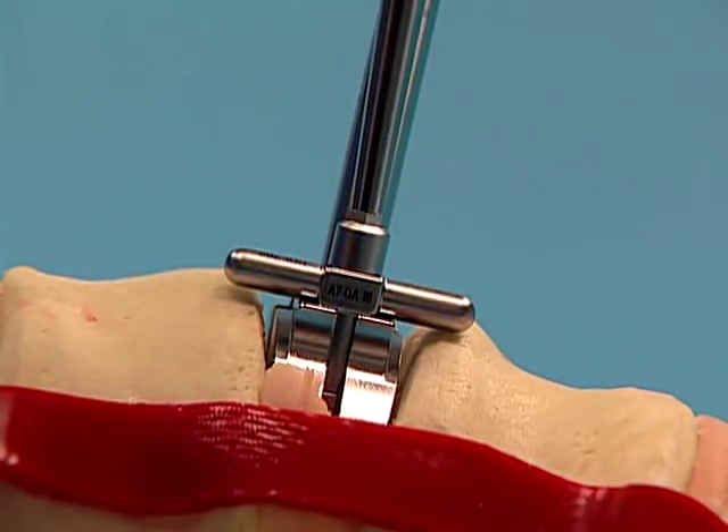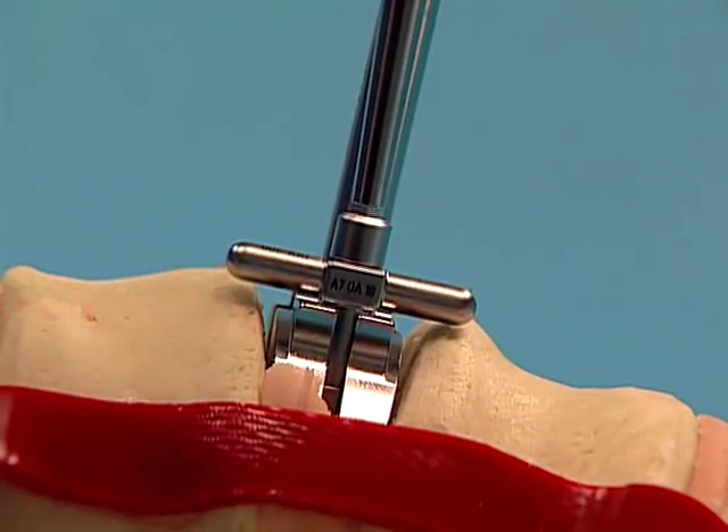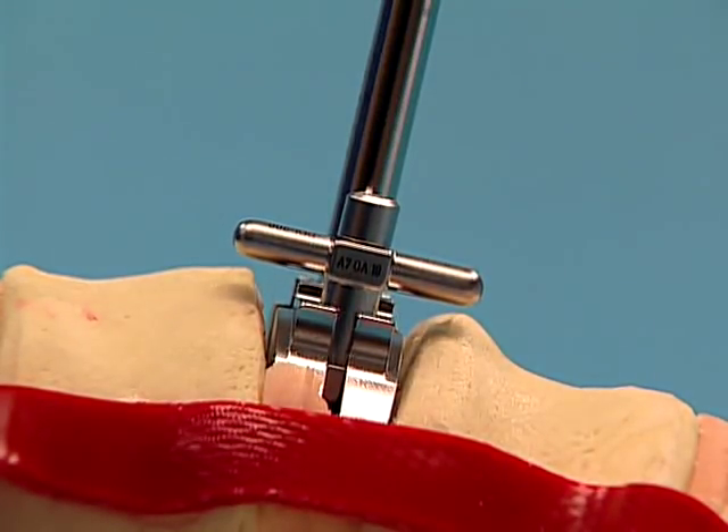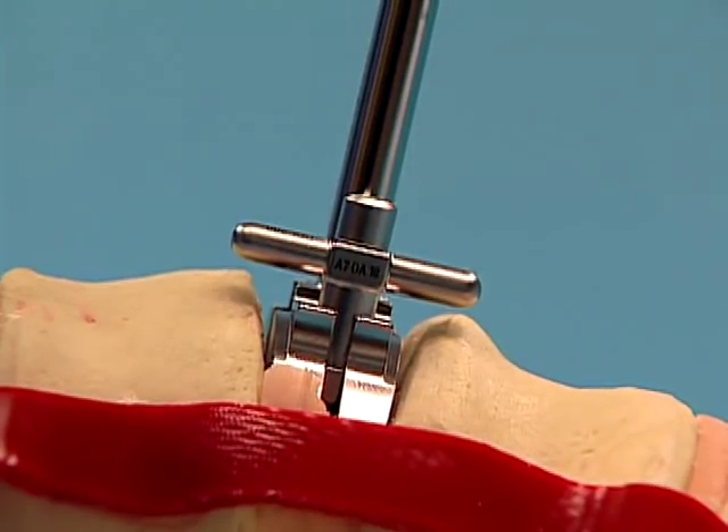If the trial needs to be placed more posteriorly, the stop can be backed out with the screwdriver and the trial can be positioned more posteriorly. Each full counter-clockwise rotation of the stop allows the trial to be advanced 1 mm posterior.